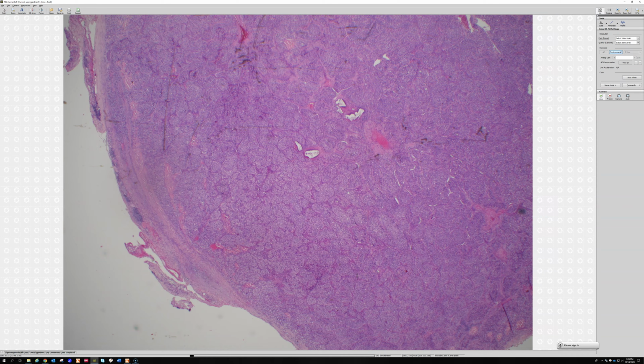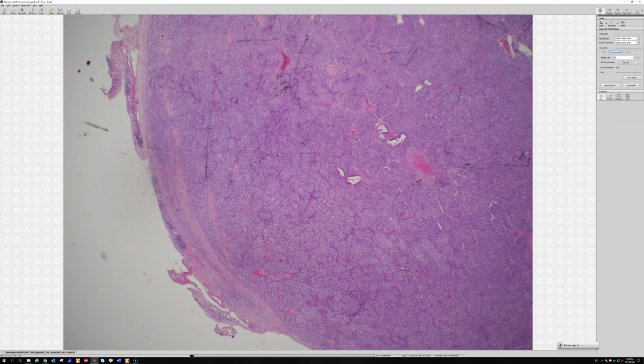Yeah, it's like a paraganglioma. Good. Yeah, I was going to say I gave away the diagnosis. It's a carotid body lesion. Once you know it's right there on the carotid, then what else is it going to be, right? It's usually going to be a paraganglioma. Exactly.